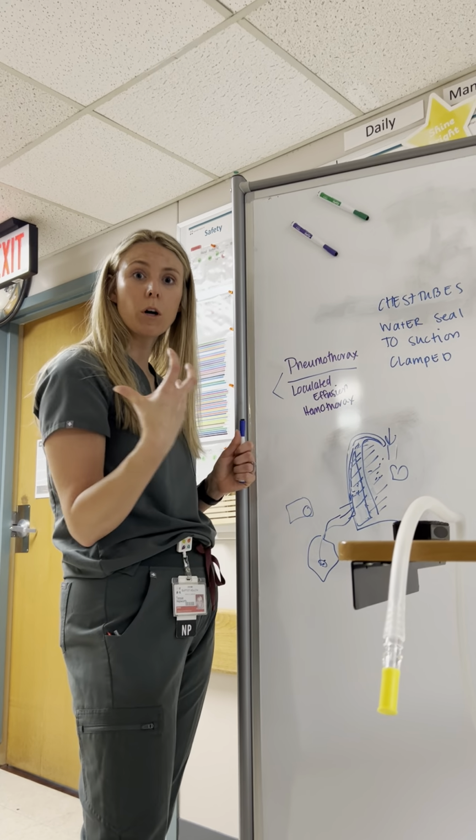We've got 500 of blood out, and over the next 12 hours we've gotten 300 out. We're trending to see, has the bleeding stopped? Have we got the infection out? Those types of things. So, the orders for the chest tube: there's to suction, which is, if you have a pneumothorax and we just put the chest tube in, we automatically are going to say yes, put it to suction.